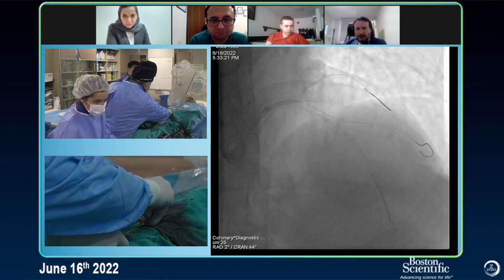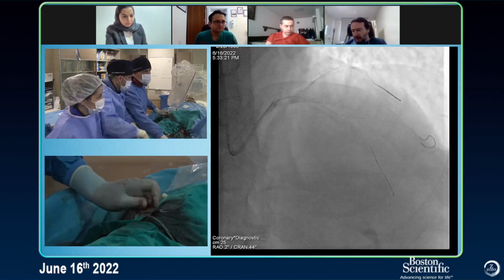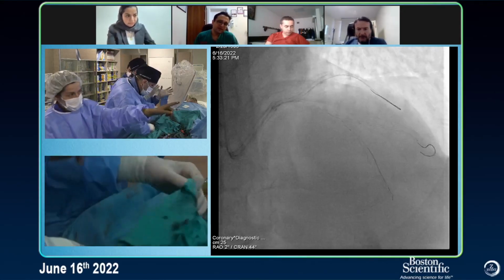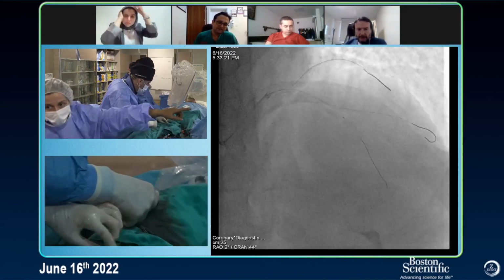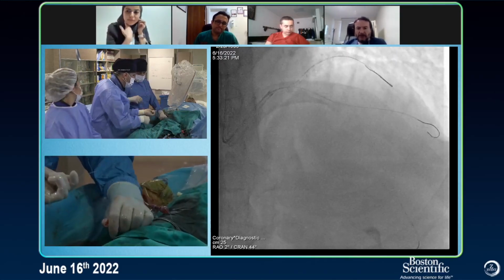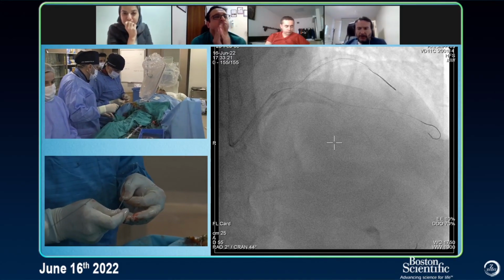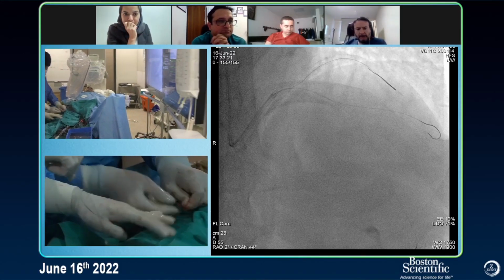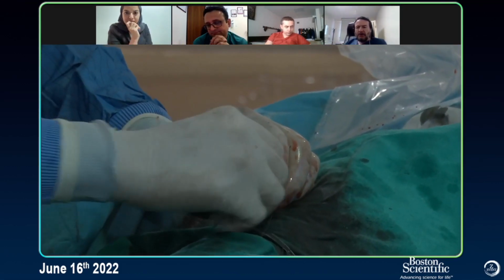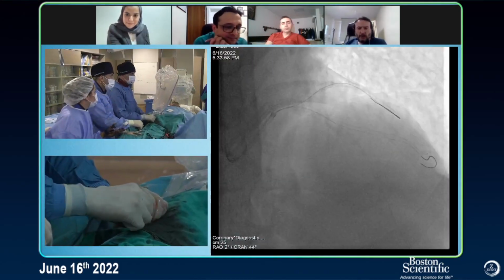The pressure is good, the patient has no pain. Pressure is good and pressure is stable. 140. The LED is there anyway. So we have a lot of time, so the others can walk in peace. Of course, we don't have to go very swiftly. We don't have any more presentations left, so sorry for that, but we will keep talking.